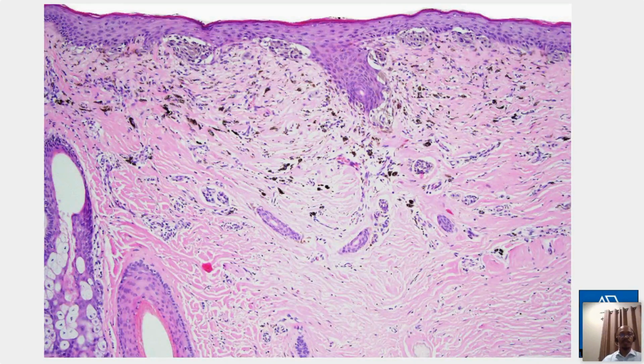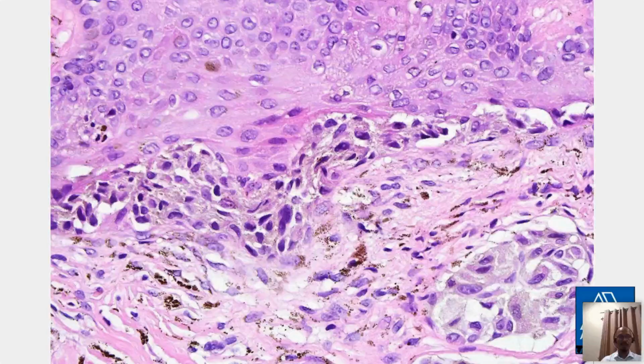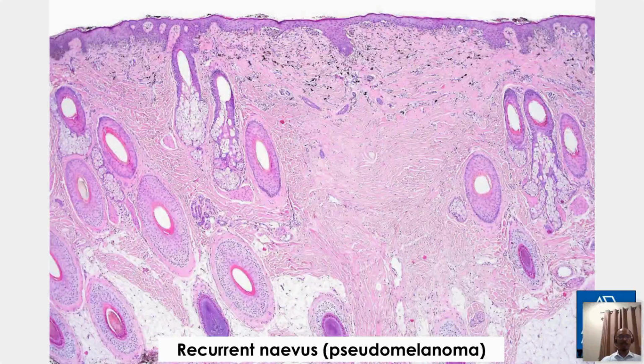Now, this particular lesion here, this was a purely junctional lesion with a little bit of, or not a little bit, but actually fibrosis in the dermis with pigmentary incontinence. Okay. And the nests had melanocytes that were atypical, but note that there's no pagetoid scatter. However, it was still worrisome because when you look at these melanocytes at higher power magnification, they're quite atypical. And in this nest here, there's actually 2 to 3-fold variation in nuclear size, which is actually worrisome for in situ melanoma.